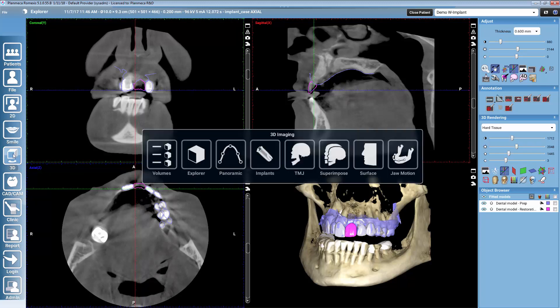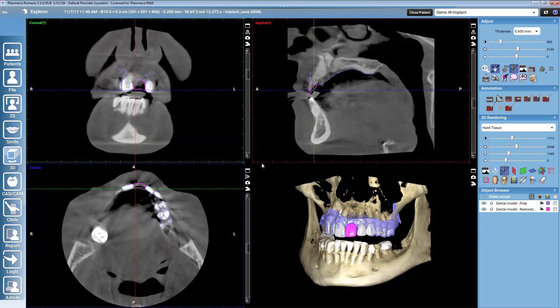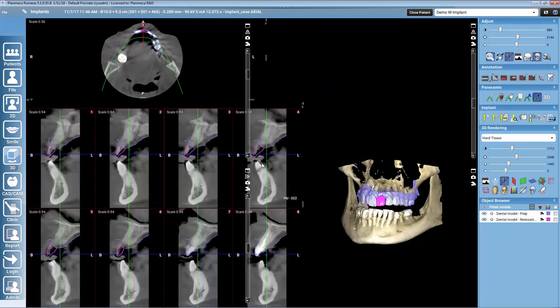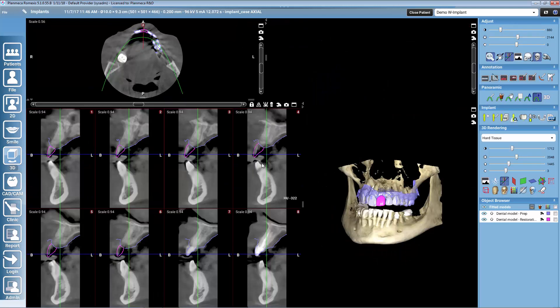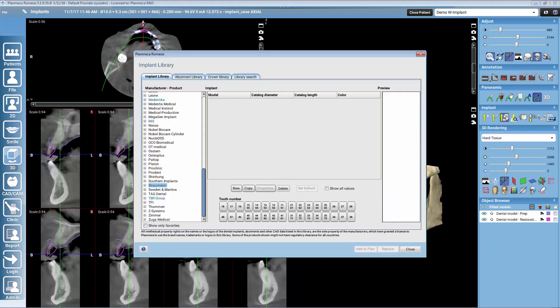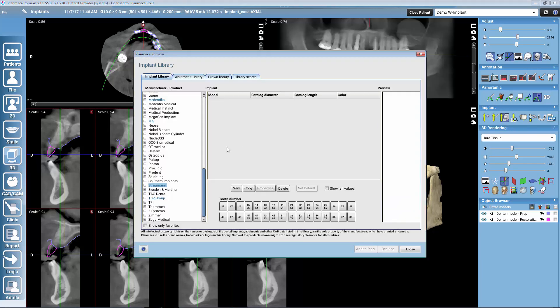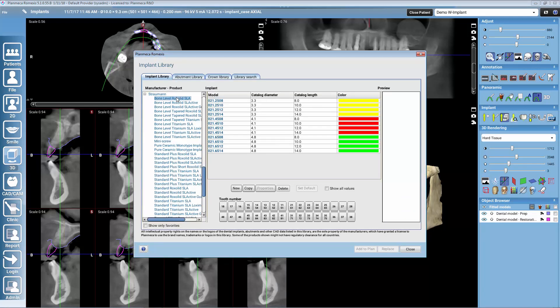From here we can move on to the implant planning module. There we will go to the implant library to select our favorite implant. I will use Straumann in this demonstration.